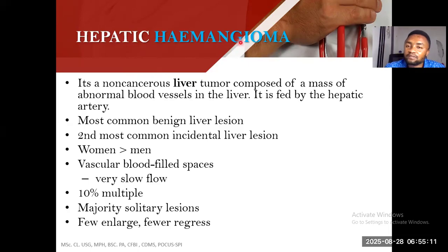Blood vessel, tumor. So it means that there is a tumor forming within a liver blood vessel. That is hemangioma, hepatic hemangioma.